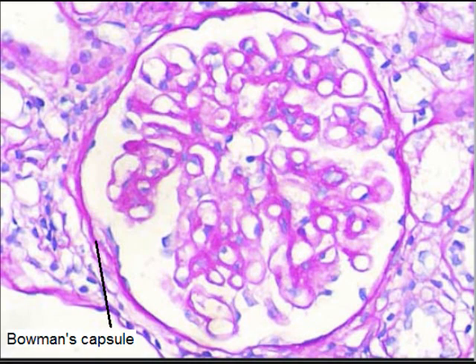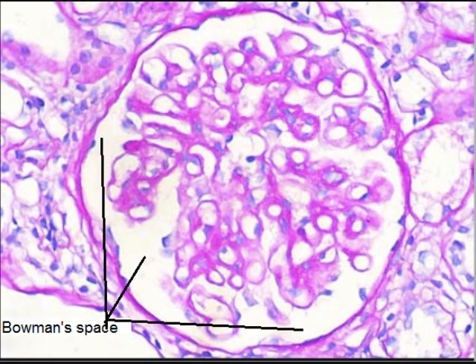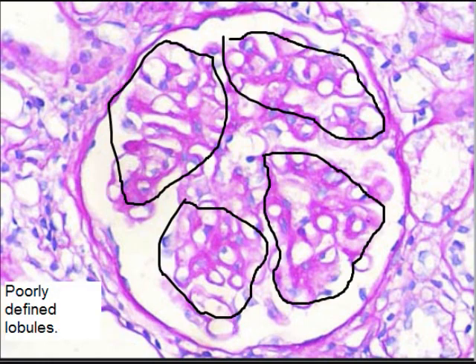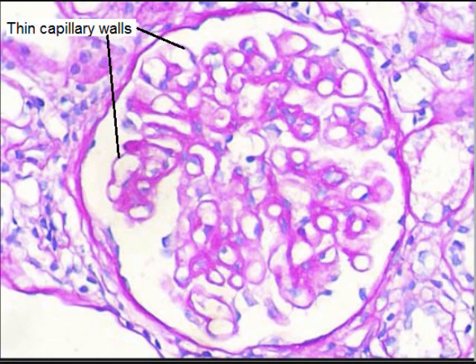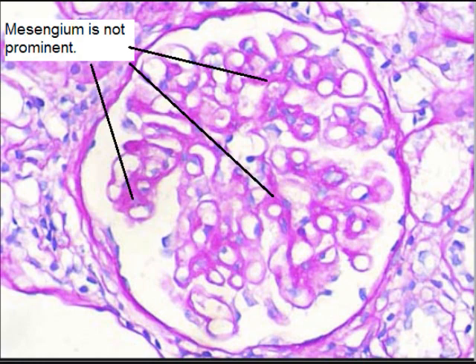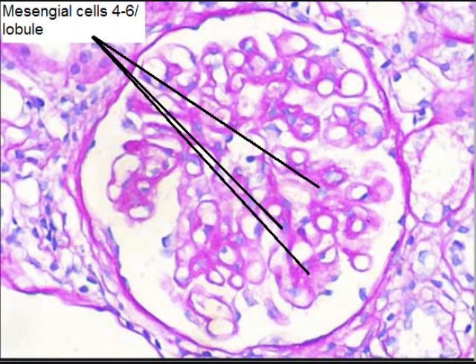There is Bowman capsule, and Bowman capsule has Bowman space, in which the ultrafiltrate is collected. Each glomerulus has poorly defined lobules — 5 to 6 lobules. There are thin capillary walls in a normal glomerulus, and the mesangium is not prominent.